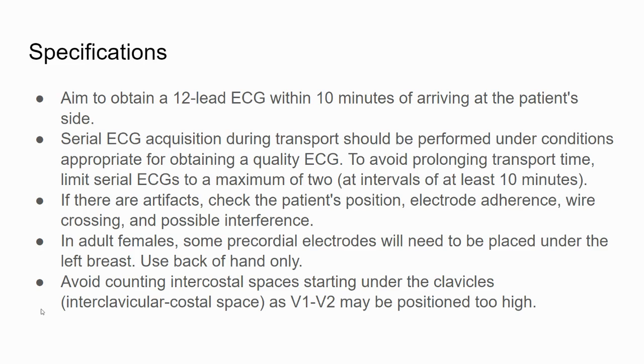This is very important, and I'll demonstrate it in class, but you're going to use the back of your hand. It's kind of hard because you can't visually see me, but you're not going to lift the breast with the palm of your hand. You're going to use the back of your hand and then place the leads on the patient's chest. It's also very important to explain what you're going to do to the patient.